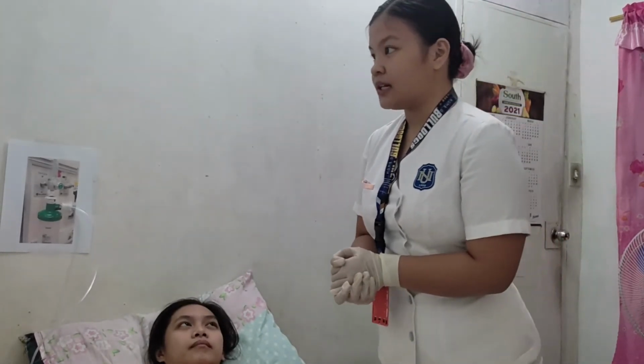Okay, so ma'am, after attaching the end of the tubing, we will now set the appropriate flow rate for the oxygen device that we will need. Since we will be administering by nasal cannula, we will need 2 to 6 liters per minute. This will facilitate effective delivery of oxygen to the prescribed oxygen device.